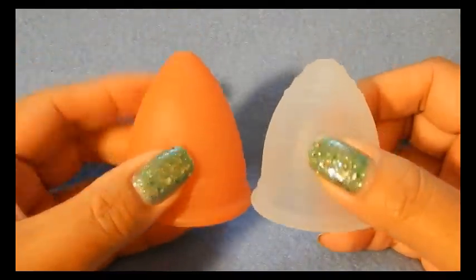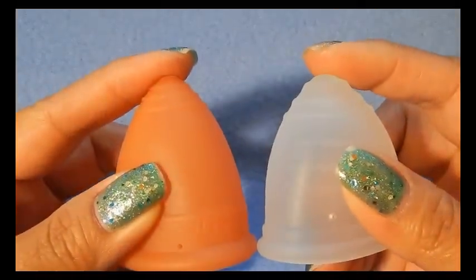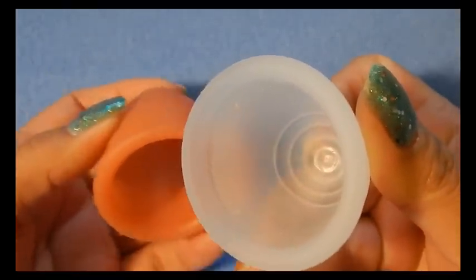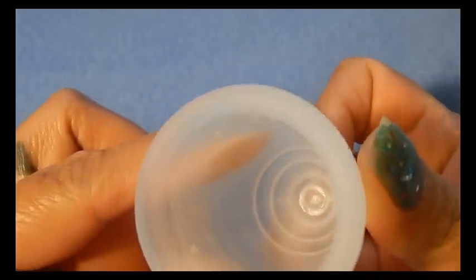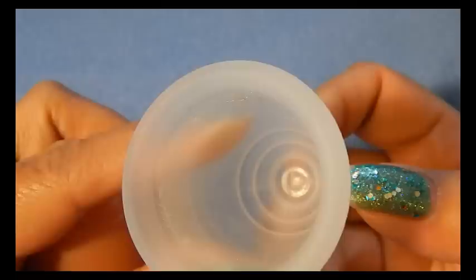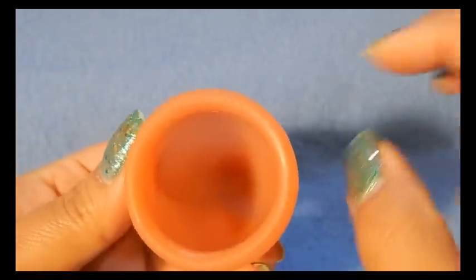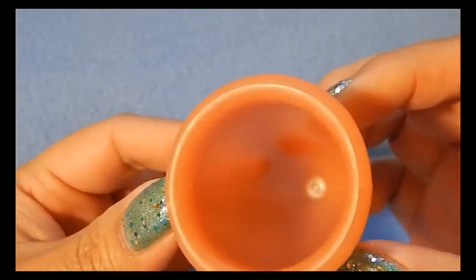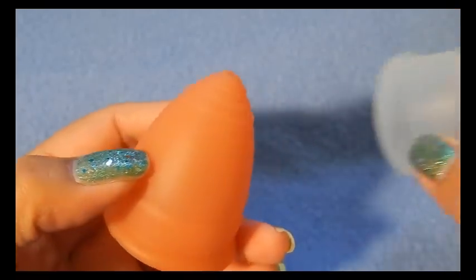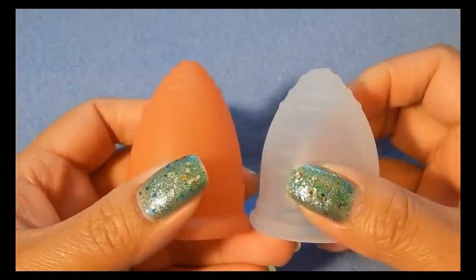Speaking of the stems, both of these cups have a really good seal, which allows you to take the stems completely off and file them down. You can see that seal on the inside of the Ruby cup and also on the inside of the Lunette cup. So if you feel like you need to take the stems all the way off, you have a pretty low chance of puncturing into your actual cup.